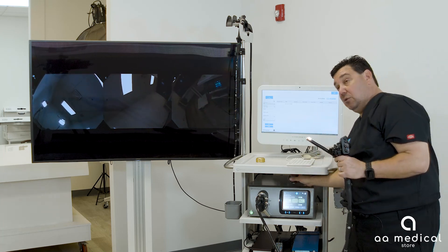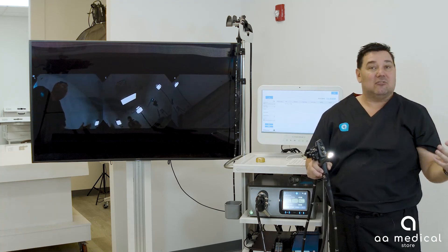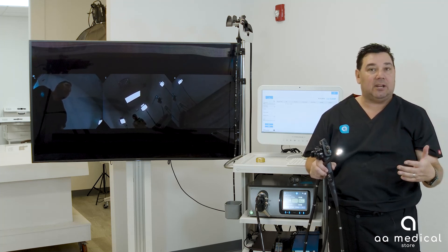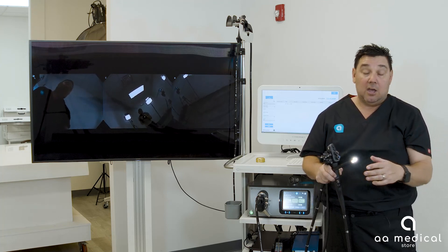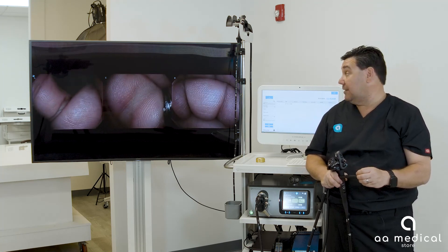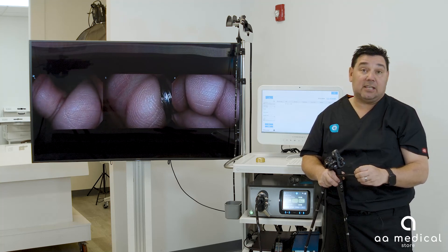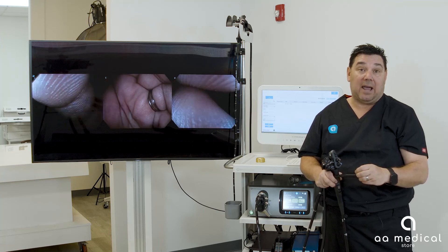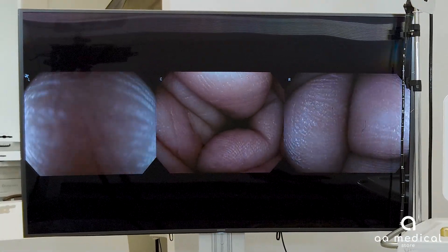Remove the white balance cap. This is an instructional video and we don't have an actual patient here, but we want to make sure you understand how the system works. Using my hand as the image, you can see on screen that the center image is in the center, the left image is on the left side, and the right image is on the right side. As I move in or back up, I'm changing my field of view from center to left to right.